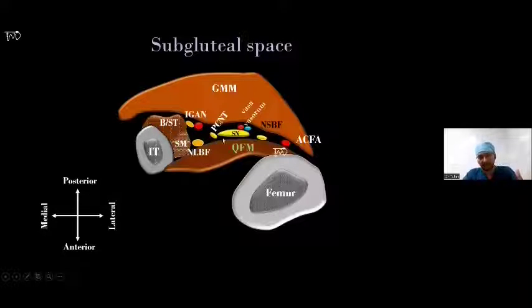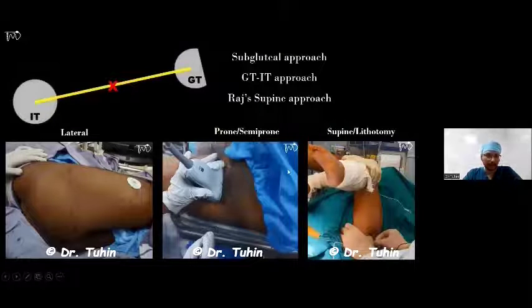So up to this level, that is the subgluteal space from the sacral plexus, I mean Mansu's parasacral approach to this approach, you can block the posterior femoral cutaneous nerve of thigh. Later, it usually becomes superficial and supplies the skin. So in other approaches, it might not get blocked.